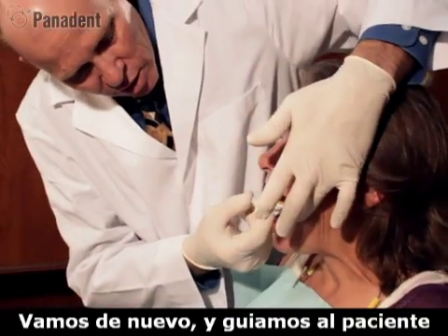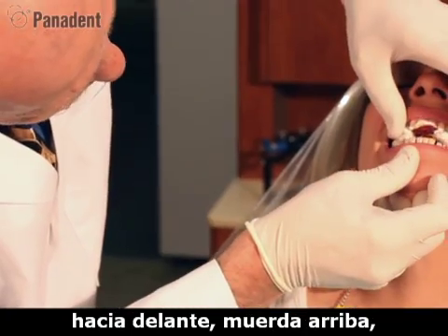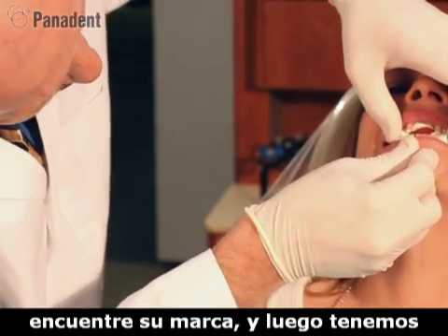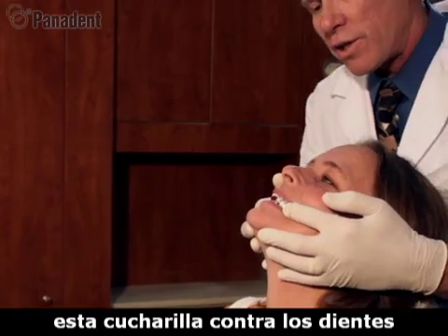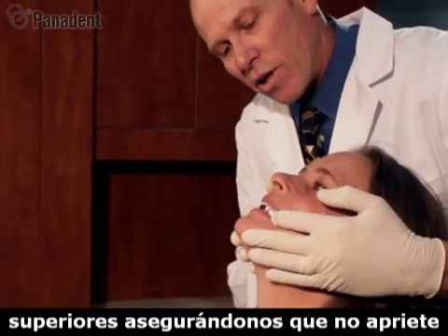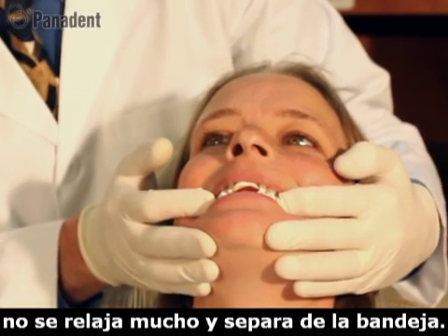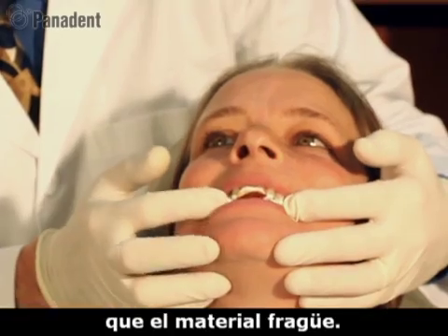Come back in, and I'm going to guide the patient forward in that protrusive check bite. Bite up, into, find your index. Find the index in there. Okay. And then we hold this tray against the upper teeth, making sure they don't clench too much, but yet making sure the jaw doesn't relax and separate from the tray. And we'll just hold this in place until the material sets.